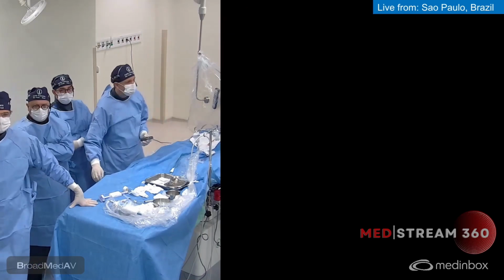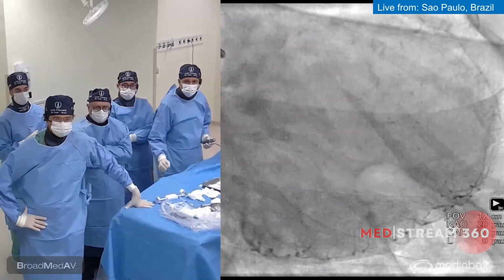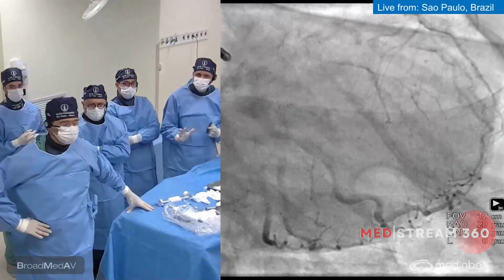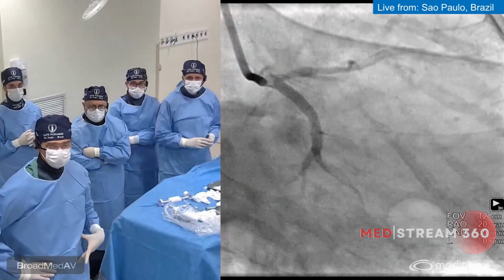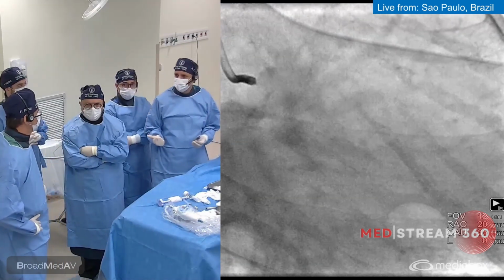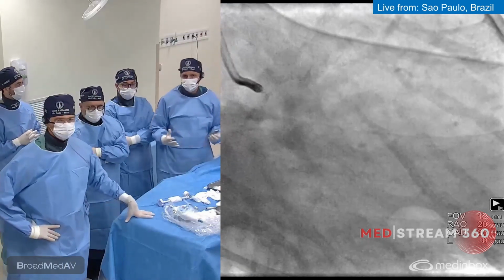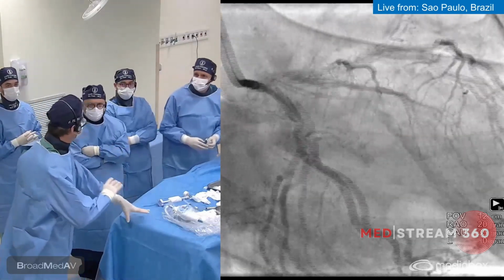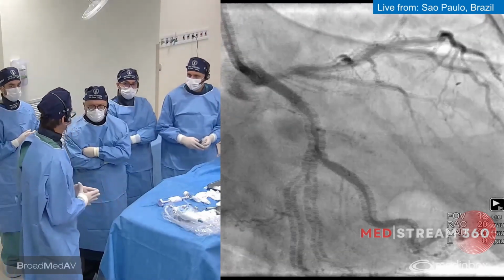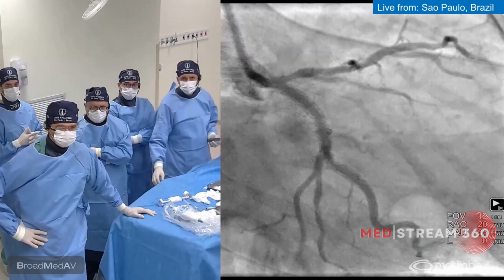So here's the angio. We can see first the RAO. So what kind of guiding catheter did you choose? We chose an EBU 7 French to have a better support, always when you're dealing with left main. I saw you chose a femoral artery. Why not radial? Yeah, she did the first angiogram by radial, and the radial didn't have a good patency anymore. Okay. That can happen in 5% of cases. That can happen with small ladies, small arms. When you puncture the radial, sometimes you can have occlusion of this artery. Exactly. It's a predictor, yes. Good. So that's why we're here with 7 French.